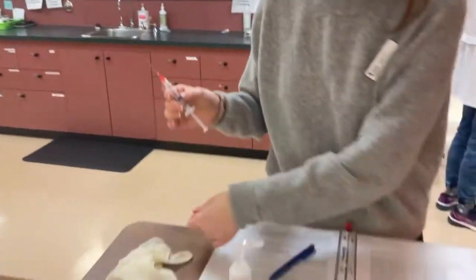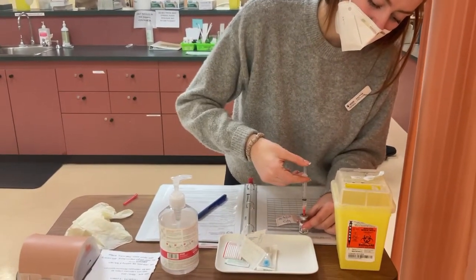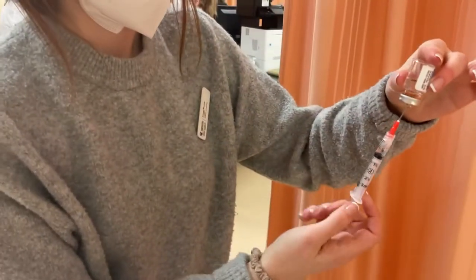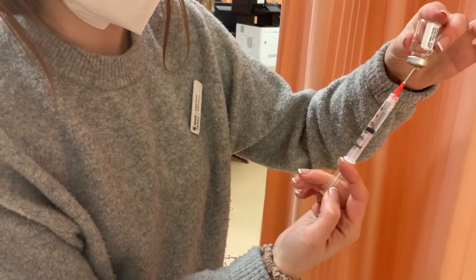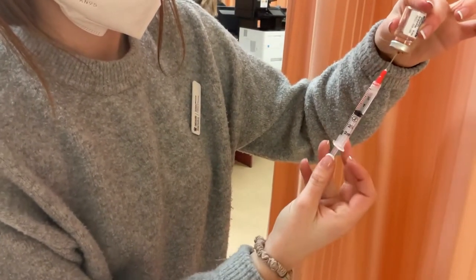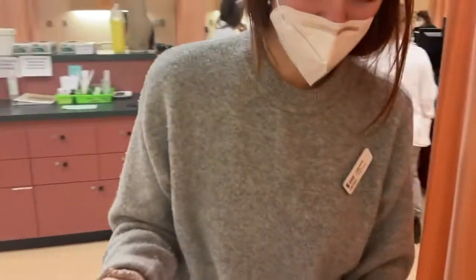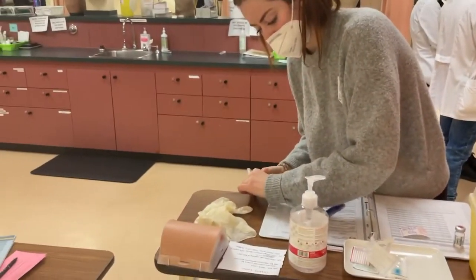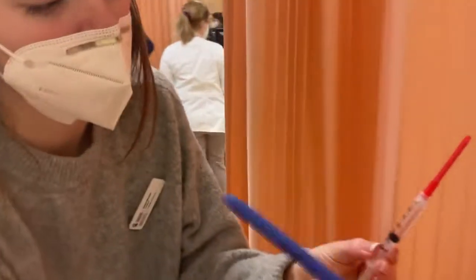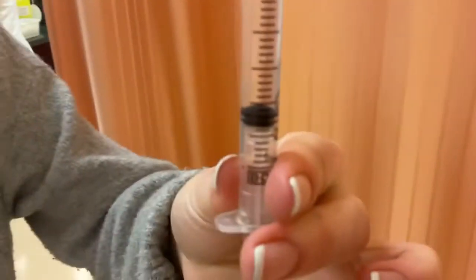I will remove the top. I will inject, and then I will put that. So I will pull the correct dose. Pull up a little bit more than I need. Remove. I will recap, and I will try to remove all the bubbles I can. Alright, it looks all good, no bubbles.